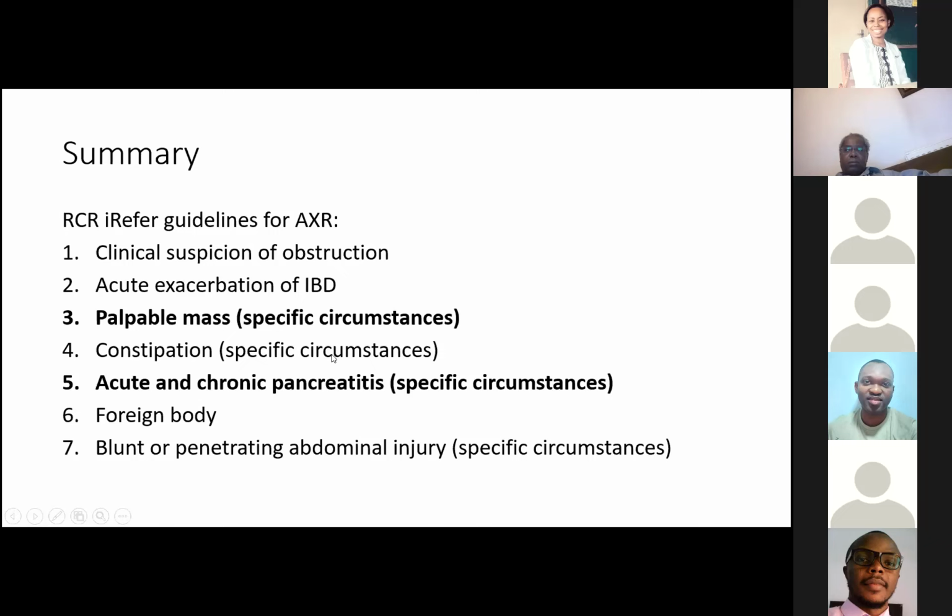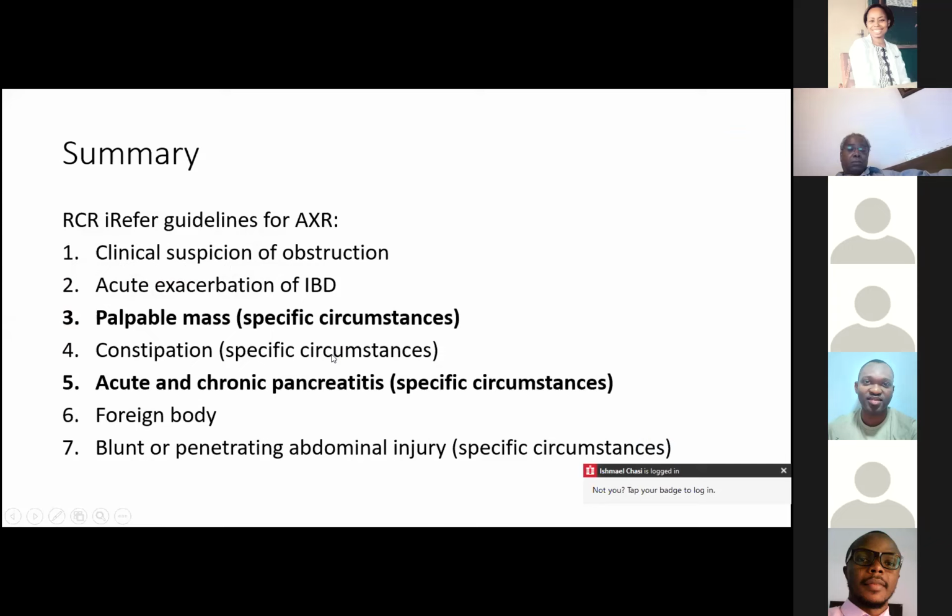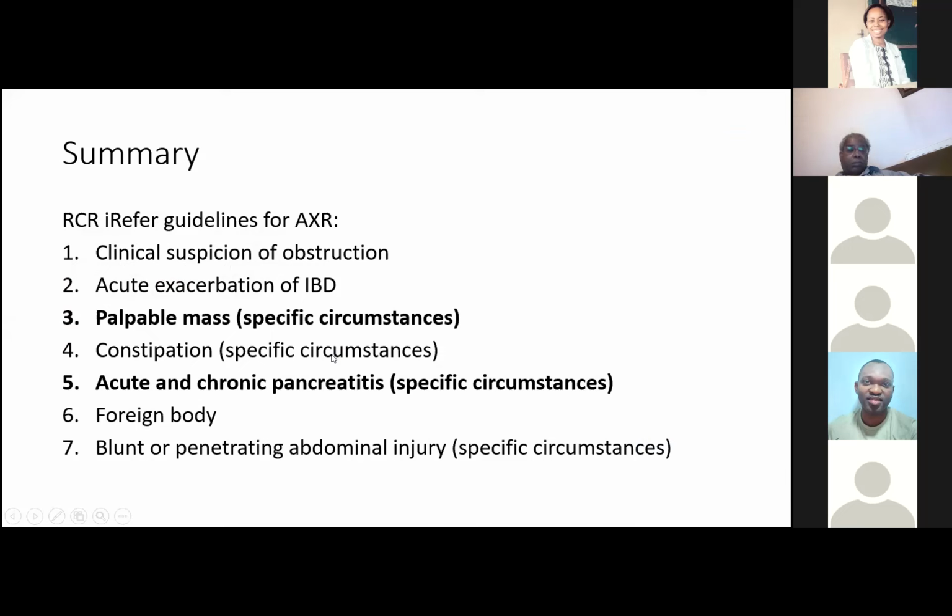So as I said, if you are doing X-rays first because you have no access to CT, just be careful of dismissing the normal X-ray. Go more on your clinical judgment and clinical findings than on the normal X-ray. I have to say it is useful, especially in younger patients. It certainly can be used, but as patients get older, a lot more pathologies come into play, and it becomes more unreliable to bank on the apparently normal X-ray.